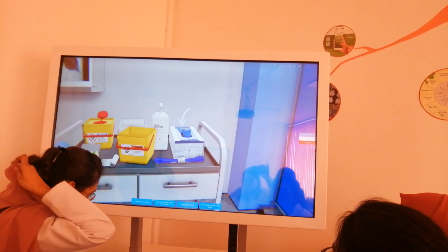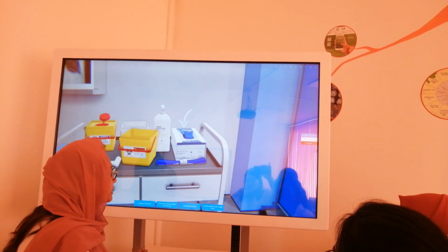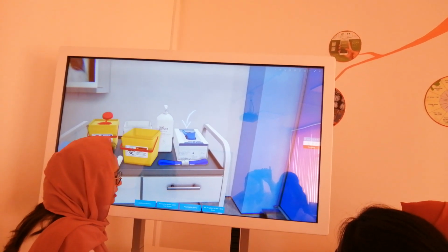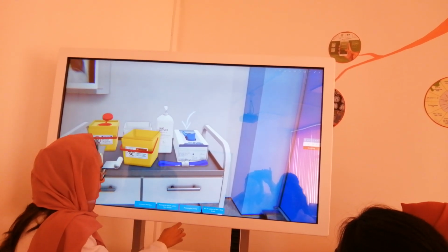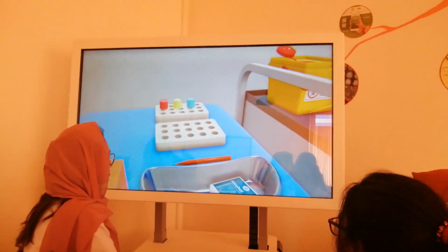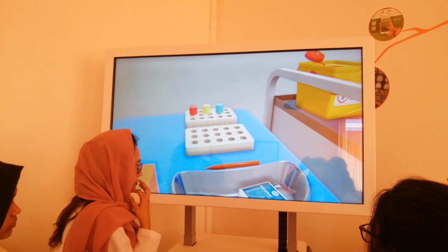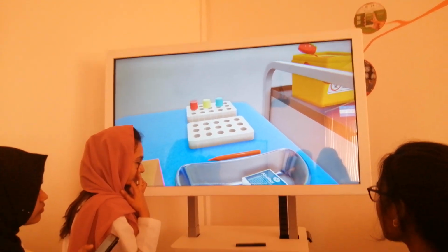What process should be the following? Labeling of test tube. Remove the vacuum system from the vein. Preparing the equipment. Ask the patient to take a deep breath. Prepare test tubes corresponding to the test kit. Red, yellow, blue color indicators. 3 alcohol and sterile gauze wipes, plaster, bandage.